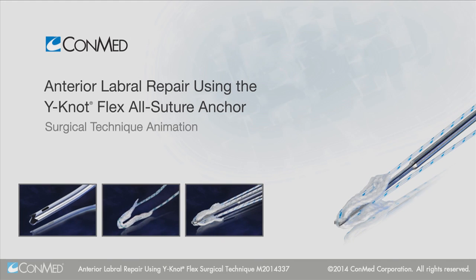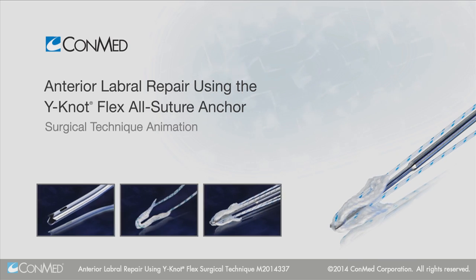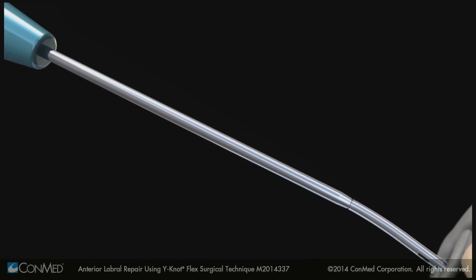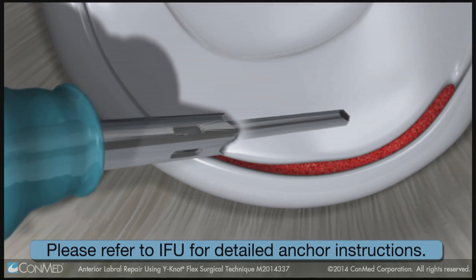This technique shows an anterior labral repair using the Y-Knot Flex All-Suture Anchor from ConMed. Curved and flexible instrumentation provide direct access and smooth delivery to the glenoid.